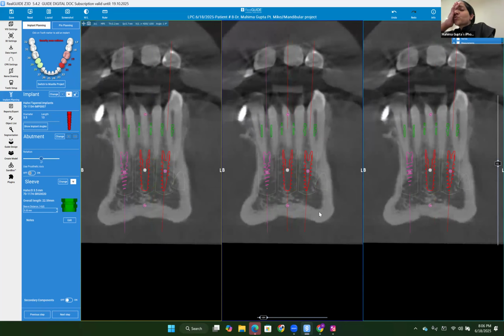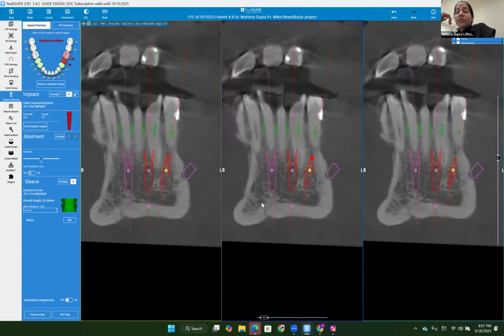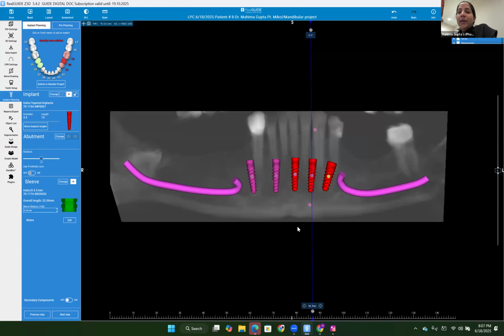So what is the best approach in this case? Just to make my life easy in future, I'm trying to understand more of the treatment planning aspect. Is it a good idea to just stay in between the foramen and give the cantilever at 19, or rather the way you said, three sectional bridges? Well, at 19, you can't put an immediate implant in. That's going to be one where you're going to have to take it out and graft it there.